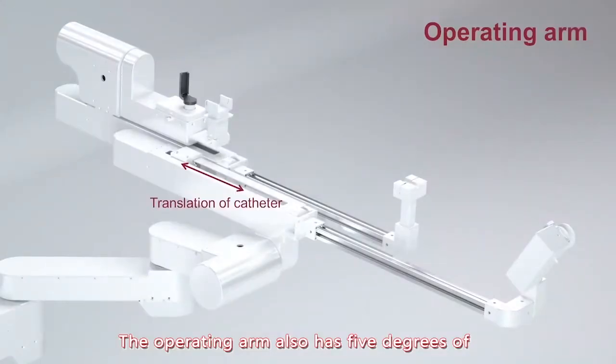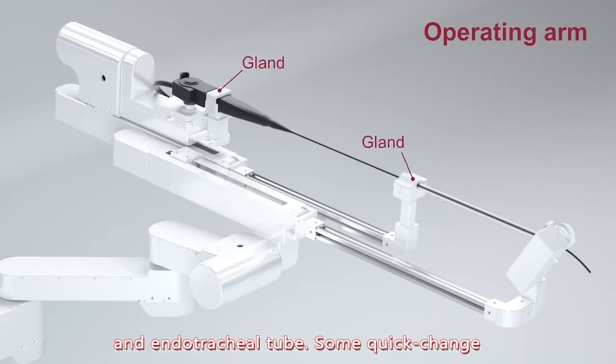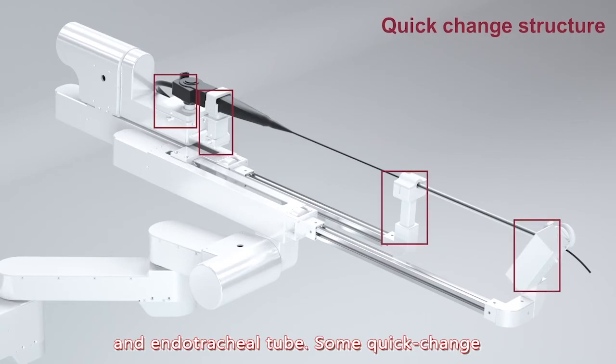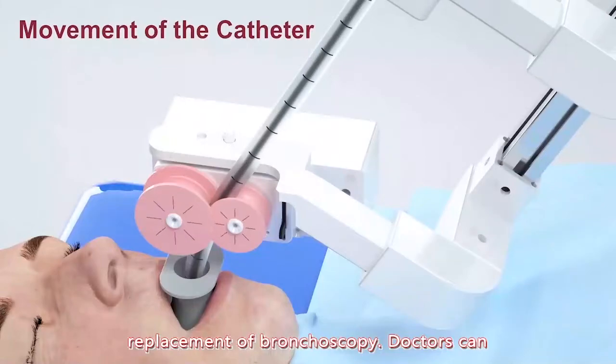The operating arm also has 5 degrees of freedom to control the movement of bronchoscopes and endotracheal tube. A quick-change structure facilitates sterilization and the replacement of bronchoscopes.